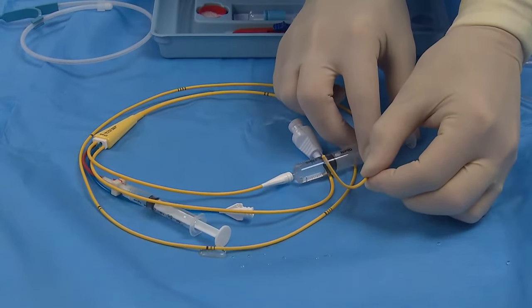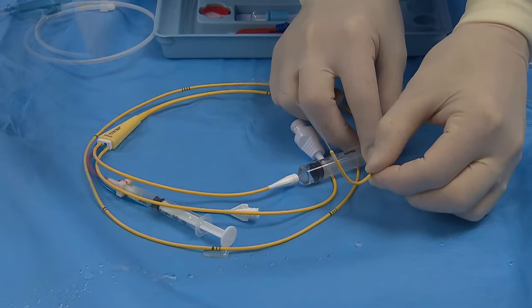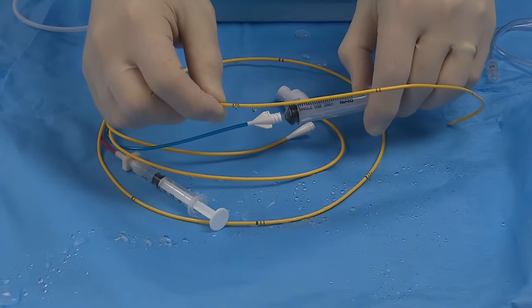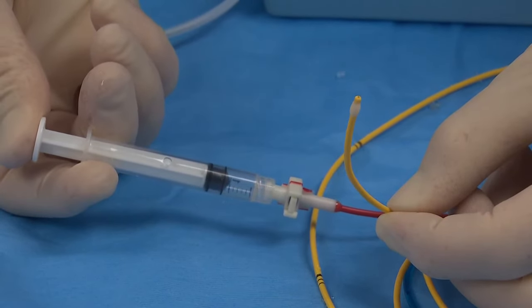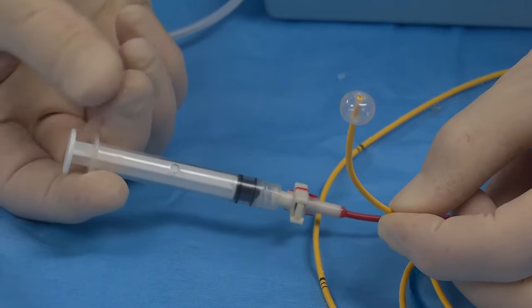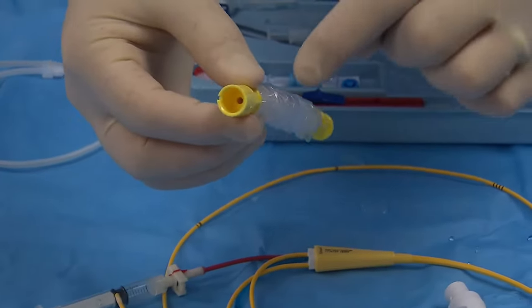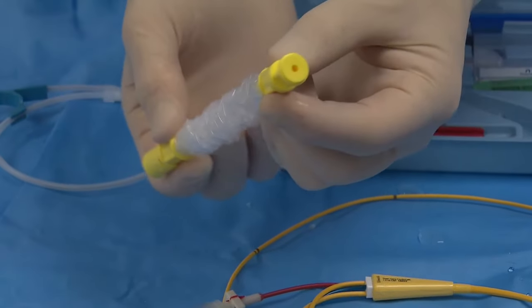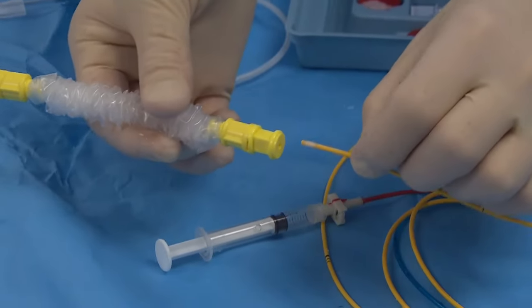During setup, it is important to ensure all necessary equipment is prepared for use and the proximal and distal lumens of the catheter are primed with saline. In addition, test the integrity of the balloon by using the 1.5 mL syringe to inject air into the balloon port. If the catheter will remain in the patient for an extended period of time, a sterile sheath will need to be placed over the catheter prior to inserting it in the patient.